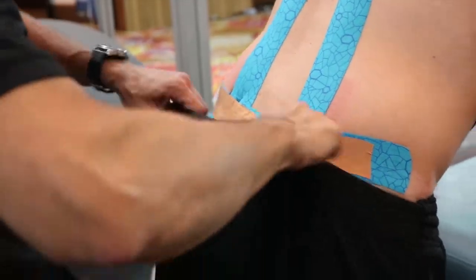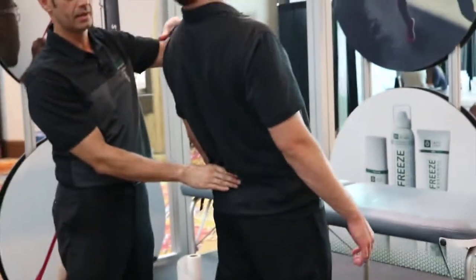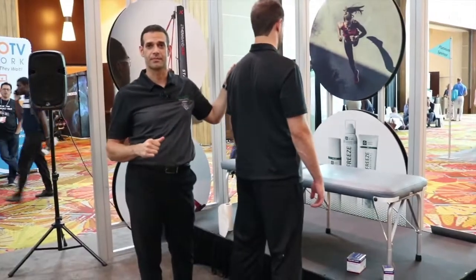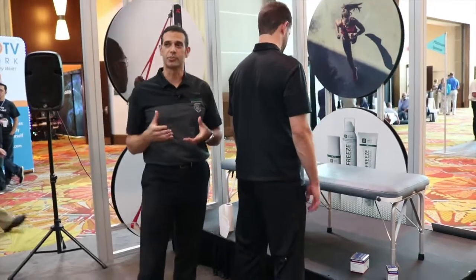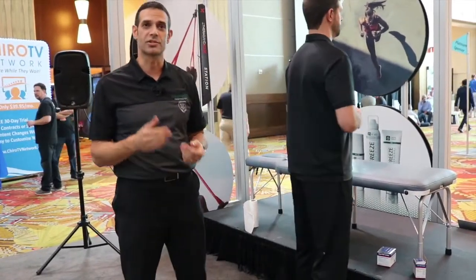And from here, we can have our patient redo their extension again, and that should, again, create our 50% reduction or more in pain as he goes into extension. Or you can see, as in this case, he goes back significantly more. Okay? So these are 2 simple tape jobs that we can use using 2 different types of applications.